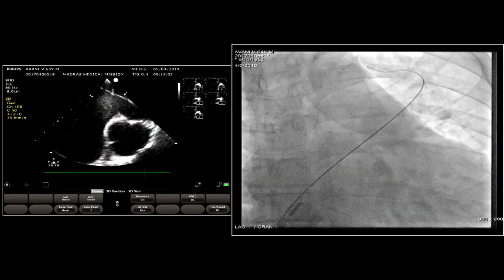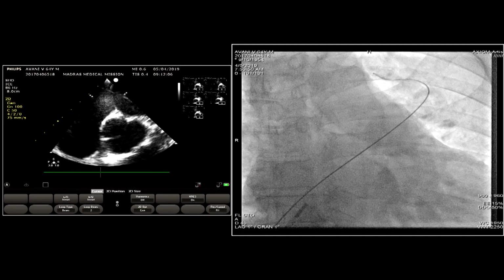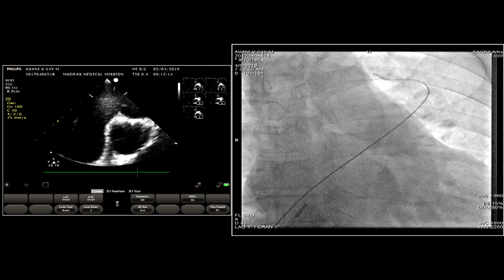Can I interrupt for a second? It's Claire O'Donnell. Look, this looks a lovely case, and I agree, looks a really nice one to close. And the hemodynamics look absolutely fine. Is there a number in terms of the hemodynamics? What do you watch most for in terms of pulmonary hypertension? Do you look at the QP/QS more than the PVR, or what number do you like?